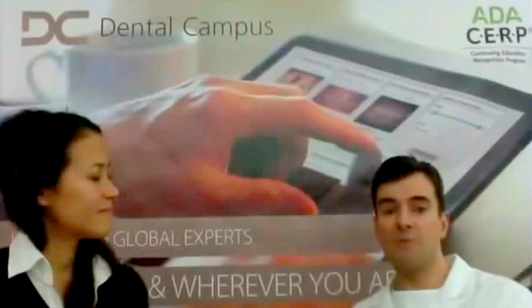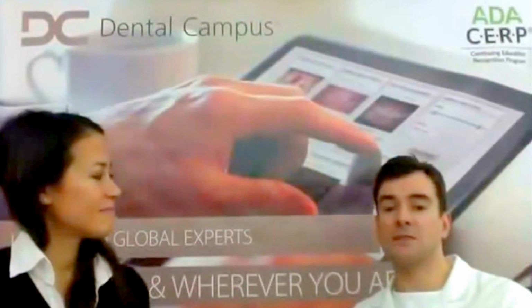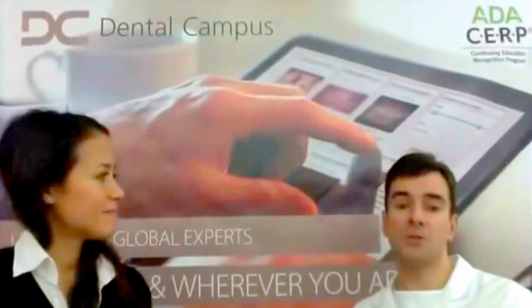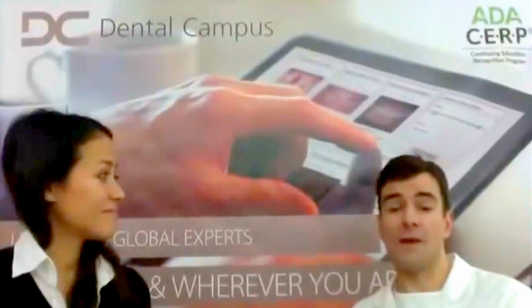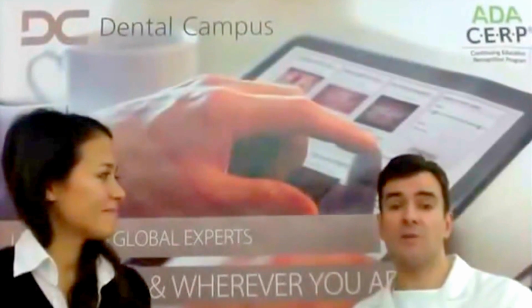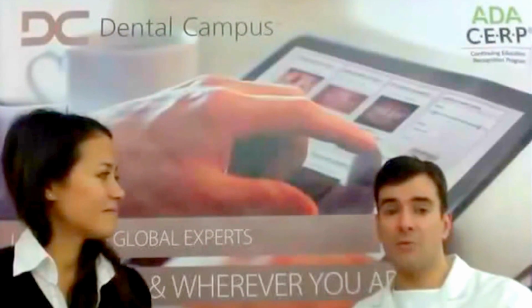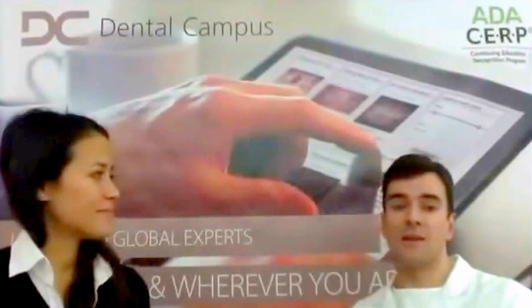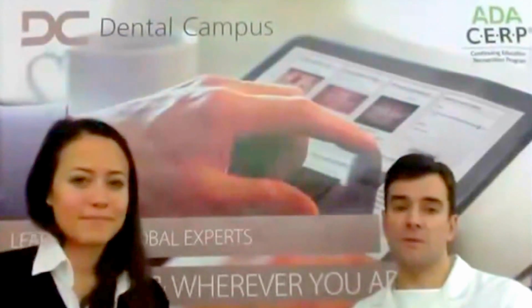It's very important to find out what the patient's desires are and what the prosthetic treatment plan is. This can be just a single crown or maybe a complex reconstruction. But only after the definition of the final prosthetic treatment plan can we correctly plan the surgical treatment.